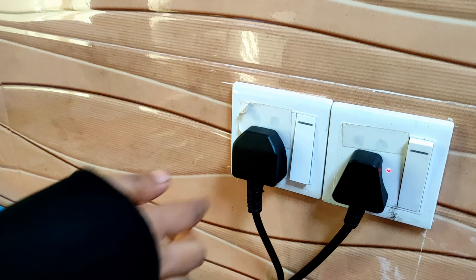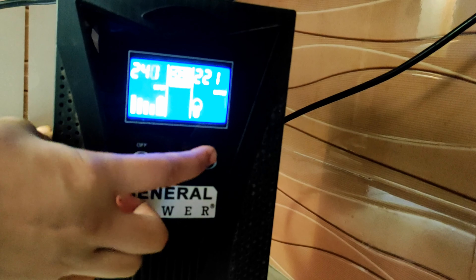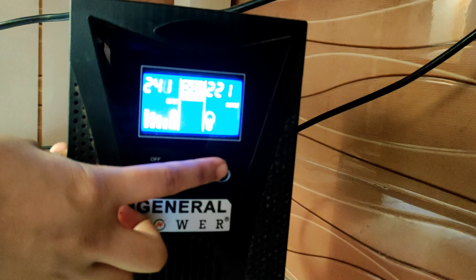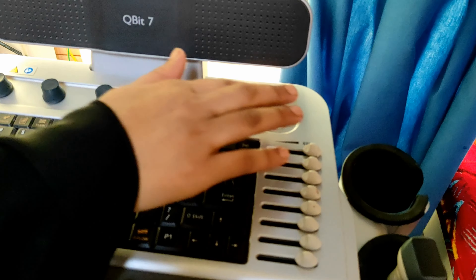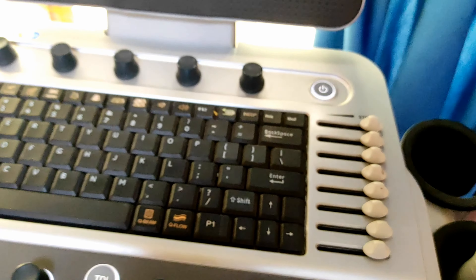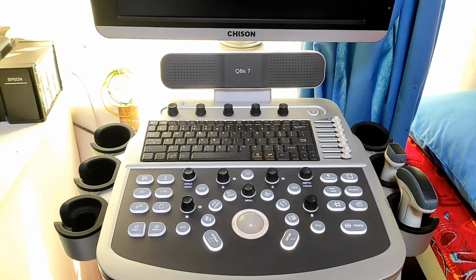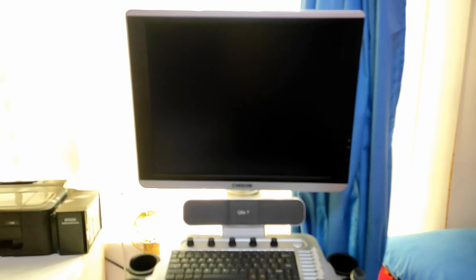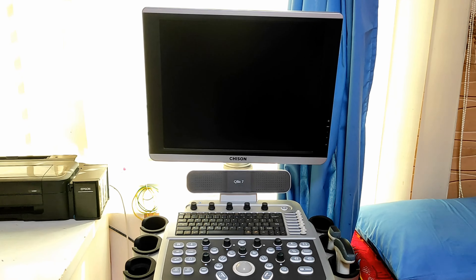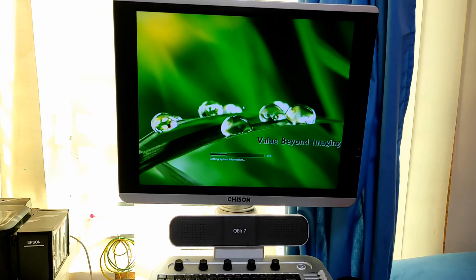Press this button for your power supply and press the on button of your power stabilizer machine. Click on this power button. See, the light is showing — that means your machine is opening. Now it is ready for examination.